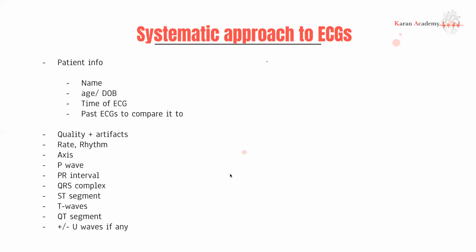Now, this is the systematic approach to ECGs, and I would recommend that for the next year, my voice just cracked. That was really embarrassing. For the next year, use this system exclusively. You can always jump the gun and say, oh, there's a very clear ST segment elevation, but please go back and go through a systematic approach.